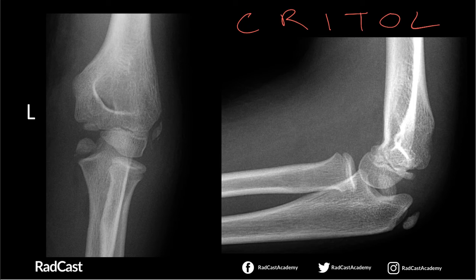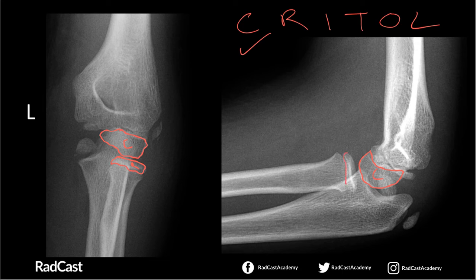Let's start by looking for the capitellum — C. Here it is on the frontal view, and on the lateral view you've got the ossification centre right here. Capitellum, tick. Next should be the radial head. Looking for the radial head on the frontal view — there it is. And on the lateral view, the radial head is also there. Tick.